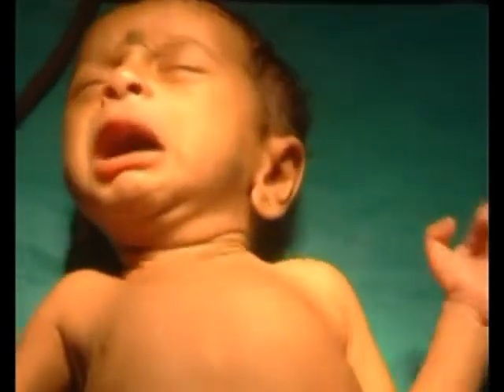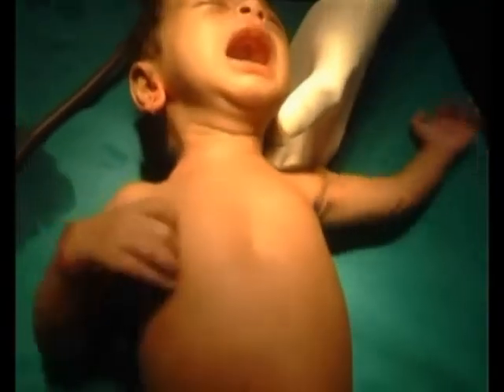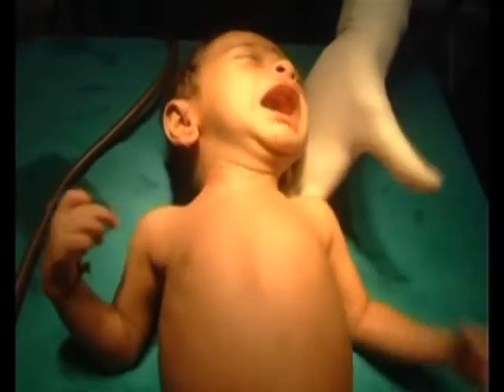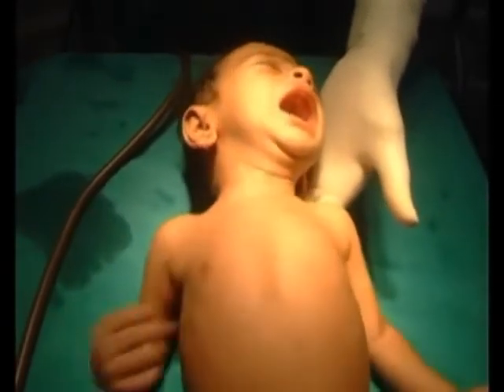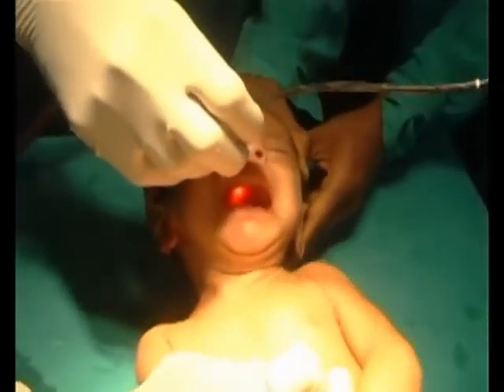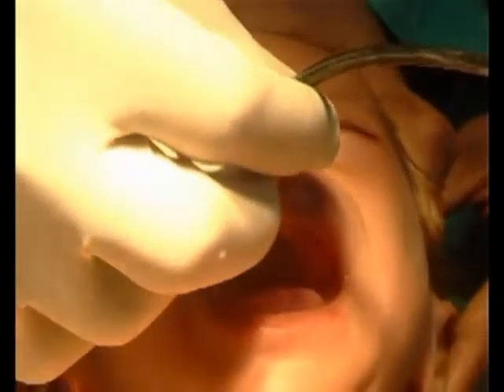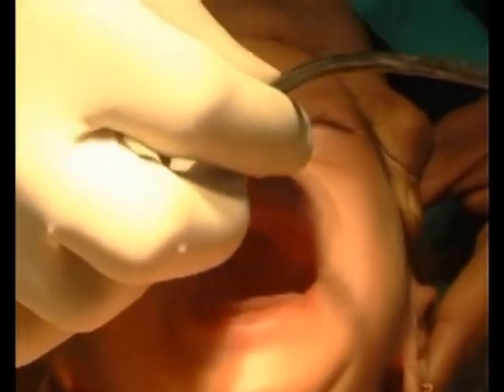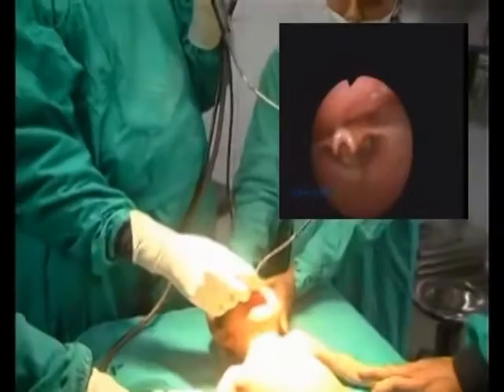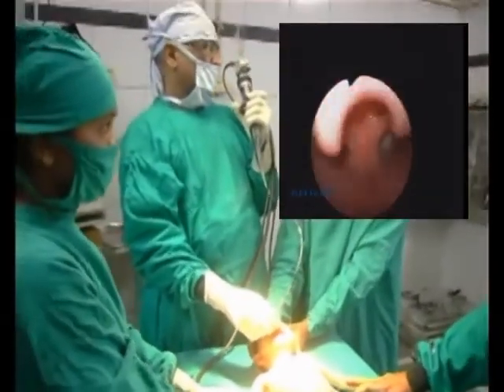Flexible bronchoscopy is done in the awake state. Transnasally, the scope is passed after decongestion with xylocaine jelly lubrication. The nose and nasopharynx are examined, followed by the oropharynx and larynx. The scope is connected to the camera and video recorded on the monitor.